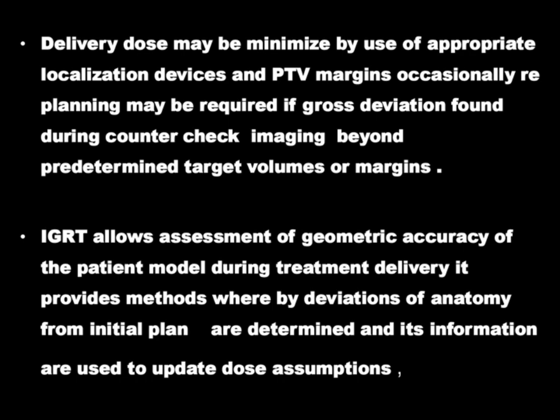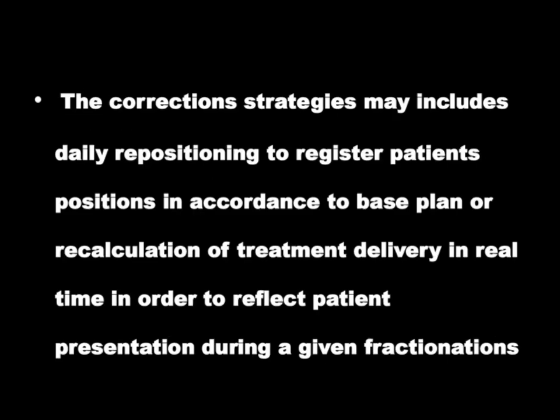Basically it is called adaptive radiotherapy. So in-room imaging application, image guided radiotherapy is a modern external beam radiotherapy technique. Techniques such as intensity modulated radiotherapy, volumetric modulated arc therapy, stereotactic radiosurgery or stereotactic radiotherapy have helped to reduce the normal tissue radiation dose without compromising the delivery of tumoricidal dose to the target volume. However, there's a great deal of uncertainty in defining the position of the target during the radiotherapy as well as in between the two fractions of a radiotherapy.